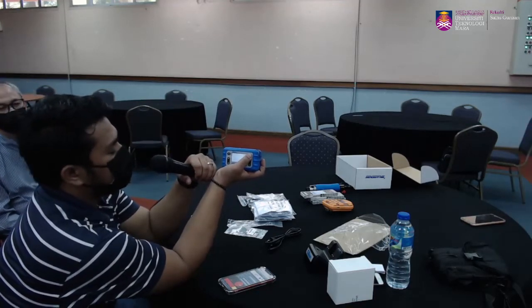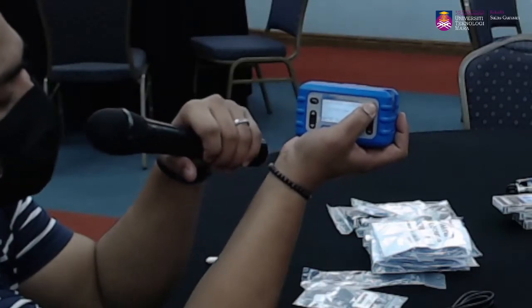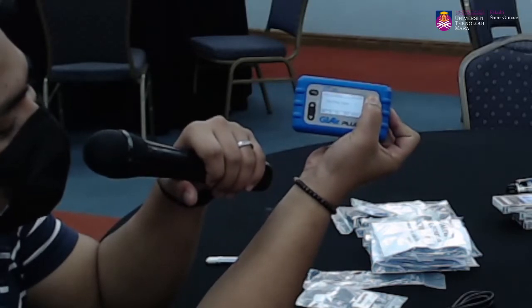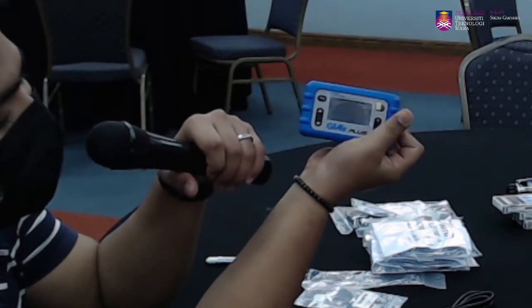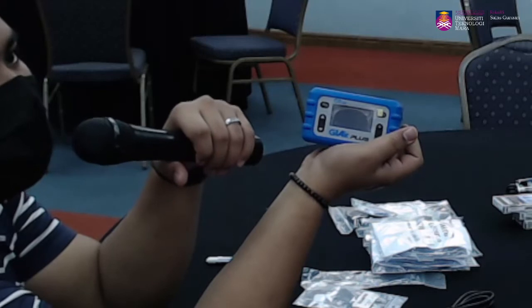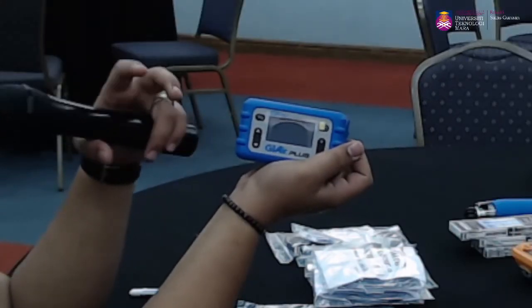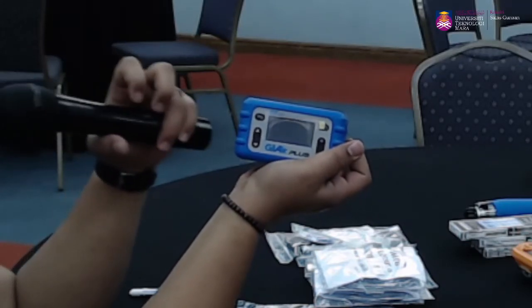Okay, so daripada situ kita nak off kan, ialah simple saja. Kita just long press dia punya enter button. So dia akan tunjuk countdown lah dekat situ. Daripada 5 seconds, habis 5 seconds, dia akan tambah lagi 2 seconds and then dia akan off. So once screen dia dah gelap, bermaknanya dia dah tutup habis. Kiranya kenapa dia sampai 7 seconds tu, is nak ensure betul-betul kita nak tutup unit tu.